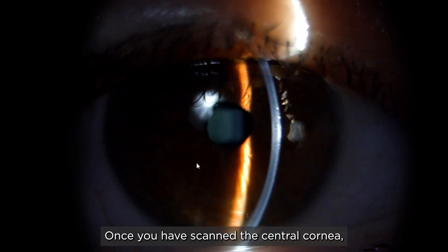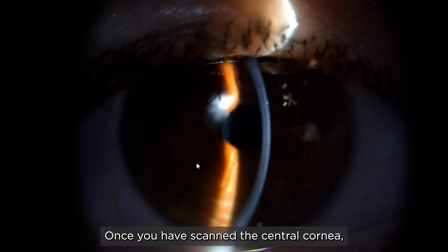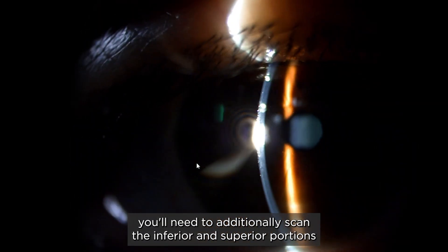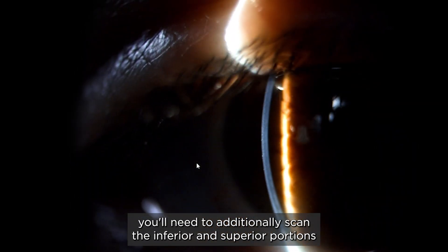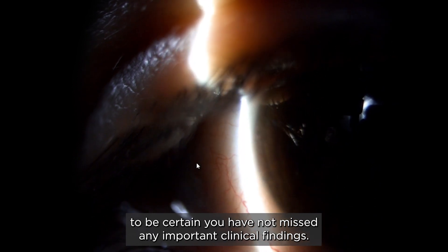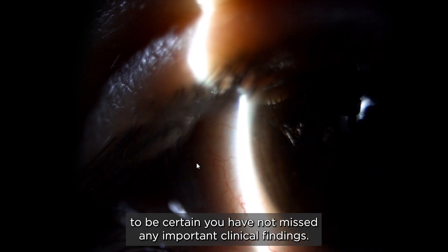Once you have scanned the central cornea, you'll need to additionally scan the inferior and superior portions to be certain you have not missed any important clinical findings.